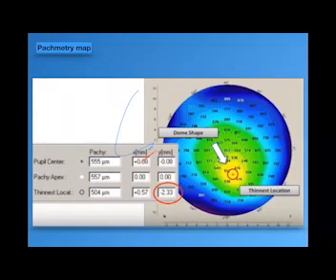If less than 465, and even a normal cornea, don't go for any ablation. Think of another option like phakic IOLs. So the thickness, 490 or more, flap; PRK down to 465. Okay.